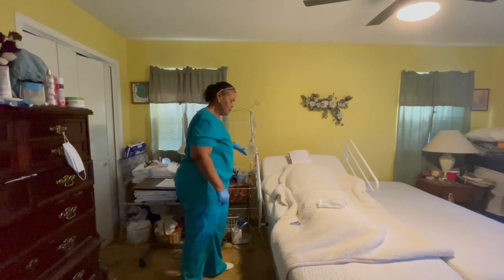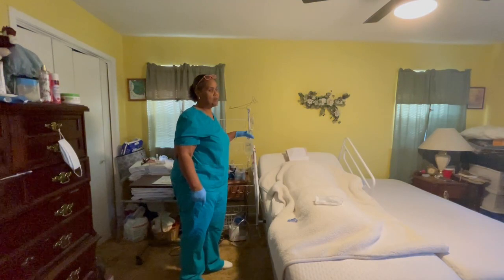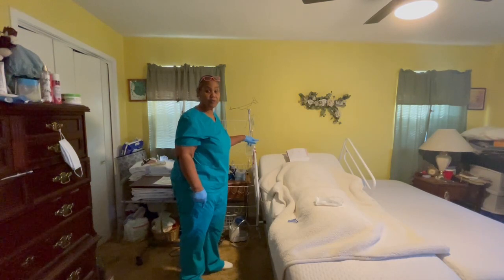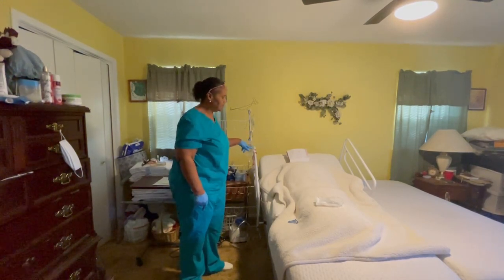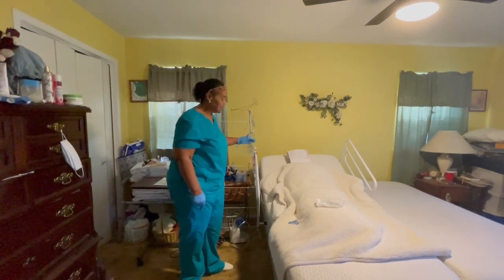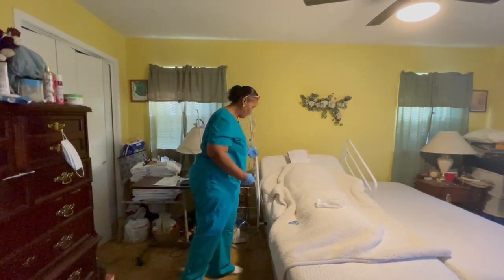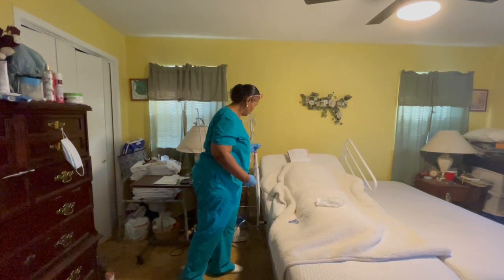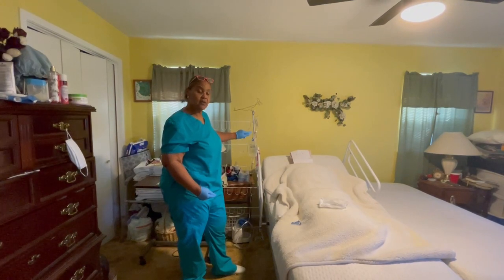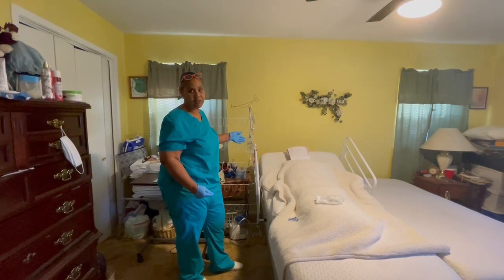I'm going to make sure on my pump, the pumps that you generally have, you program them to, it's going to be 100 mils as my volume, and then my time expected is going to be 30 minutes because it's going to ask you that. All you want to do is make sure when you look at it that it is telling you what the rate needs to be, okay? Once you do that, I'm sorry, I also need to put my label on my tubing so that my coworkers will know when it needs to be changed depending on the policy and procedures of your facility, okay?